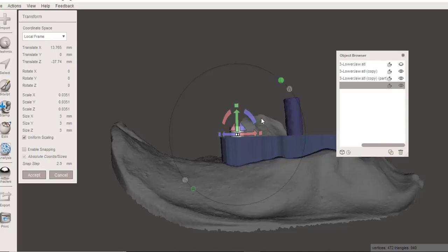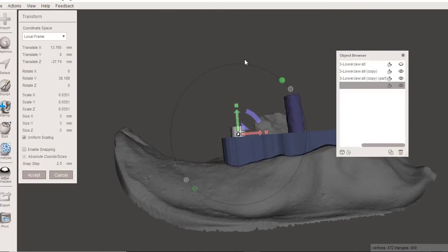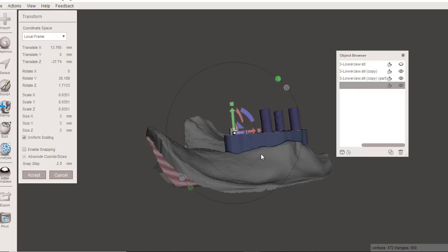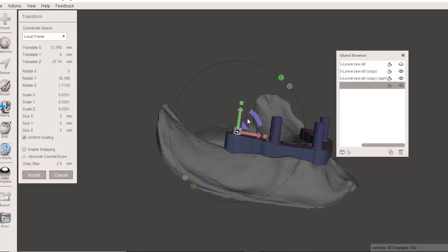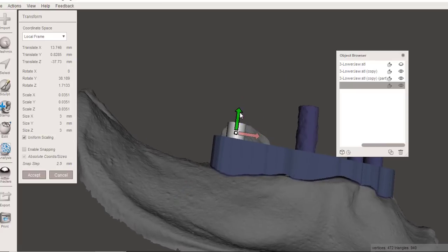Okay, so what I want to do is get this thing as ideally positioned as possible to the ridge, because I'm going to make all of these things parallel. And I'm setting the path of draw of my bar right now of how it's going to go onto the locators. Okay, so I've got this here. I'm going to sink this down. It's only 2.5 deep. That's probably good. I'll sink it to about right there.